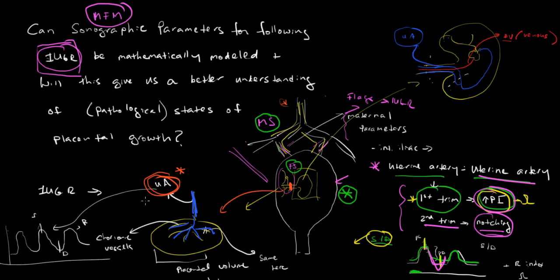Once again, it's similar in a way to the uterine arteries, because it's an arterial pulse. You have your zero level, but then you have your systolic and your diastolic. The difference between your systolic and your diastolic is calculated by your software into your pulsatility index. And that could also determine a resistance value. And once again, the greater your pulsatility index and the greater your resistance, it starts to suggest that there's a problem. So the first thing that you start to get is an increased pulsatility index and increased resistance now in the fetal circulation. And that could progress even to something worse.